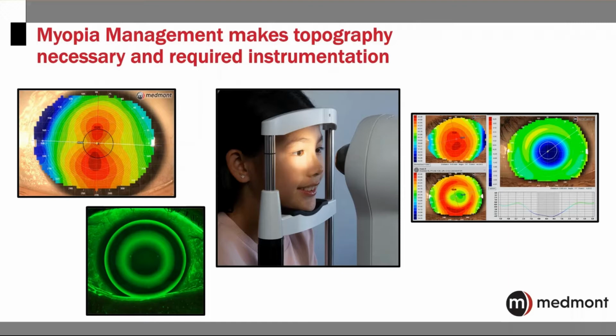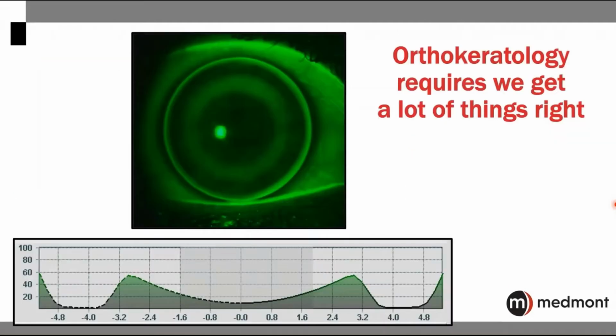How do we use this tool prior to orthokeratology treatment to understand candidacy? How do we use it post-treatment to assess the outcomes and determine if changes are necessary and what those changes should be? Now, in designing an ortho-K lens, we know that we have to get many things right. The base curve to cornea relationship, the sagittal depth, the alignment with the peripheral cornea, the edge lift, the toricity, the diameter. There's so much that needs to be designed appropriately for an ortho-K lens to fit optimally.